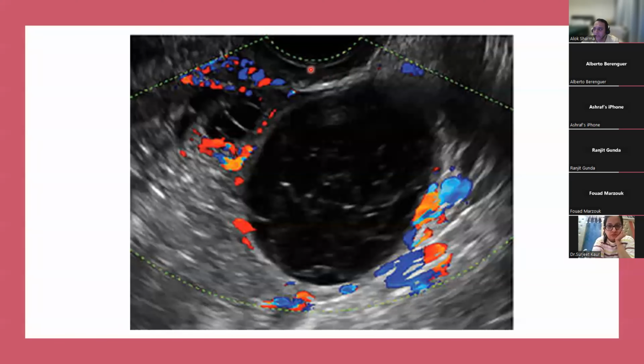Now, the density of skin and soft tissue is going to be very different to the density of a very large cyst which has fluid in it. This fluid also has exudate, with these areas of exudate that you can see. When sound waves pass through it, as we talked about, if you have differences in density and velocity between the soft tissue and an area that has a lower density, you're going to get a lot of reflection back. That's why you can see that this area of soft tissue is echo bright.